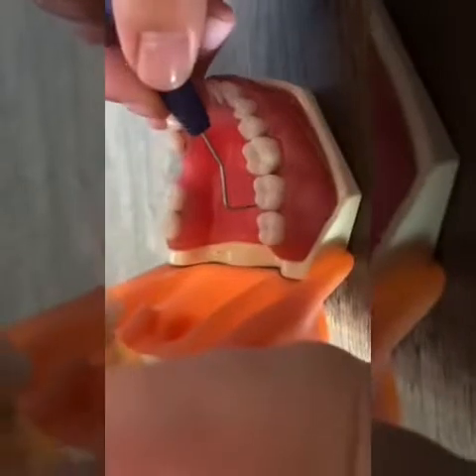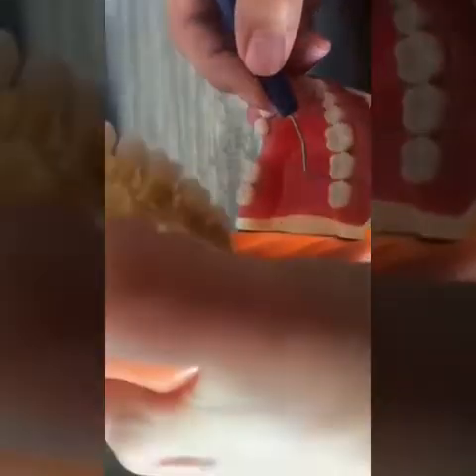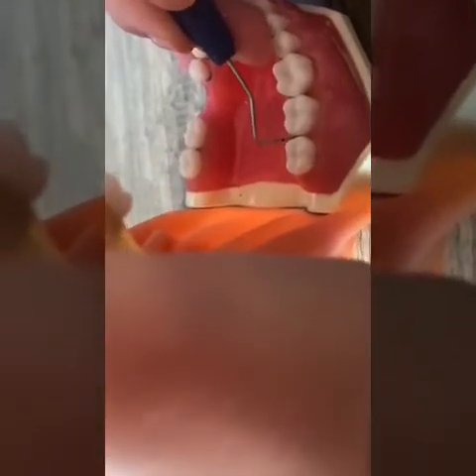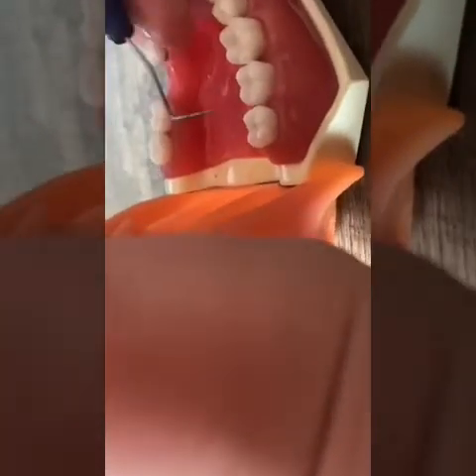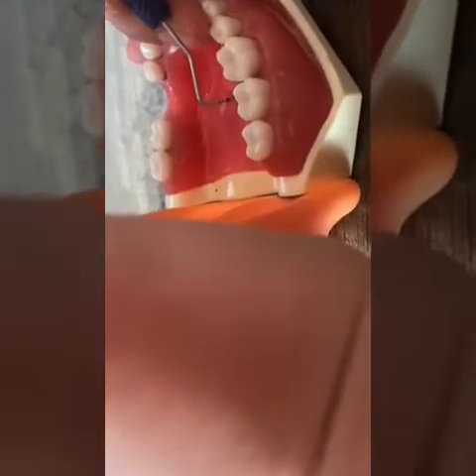We're going to insert our instrument so it's parallel to the root of the tooth. So this is going to be the distal line angle. And then we're going to walk the probe into the interproximal area. And again, tilt the instrument so it's 10 degrees, and we record. That's when we take out the probe, and we start again at the distal line angle. We walk. Okay, we get our fifth reading.